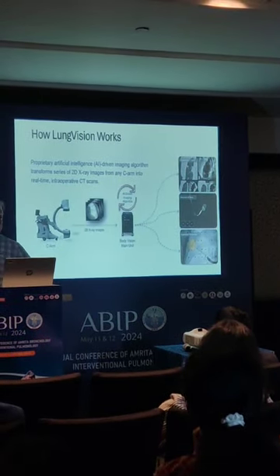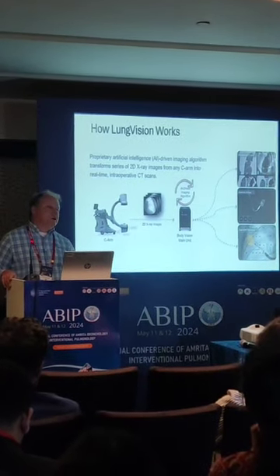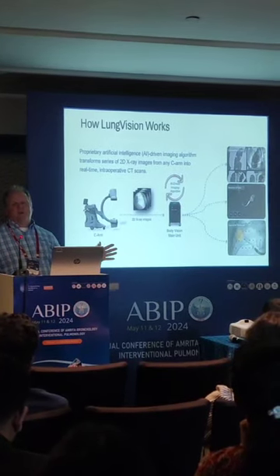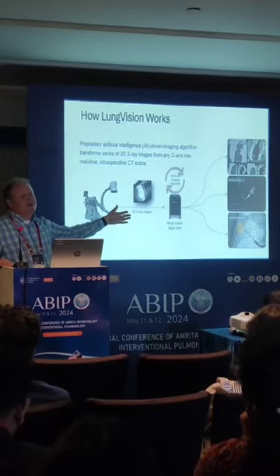That's unbelievably important. Because sometimes, especially when everyone swore this had to be cancer, and you're busy proving it's not cancer, you're going to be told over and over how much you must have missed it. And when you show them that video and you go, I didn't miss it, can't be more dead center.